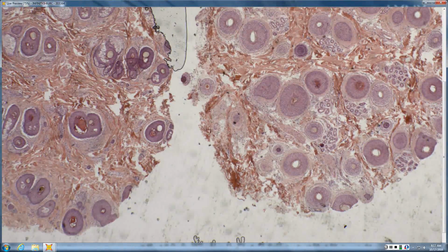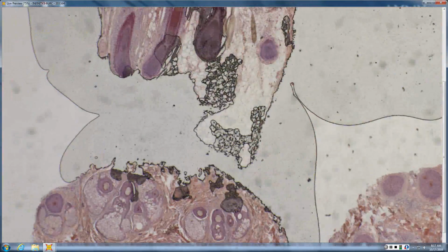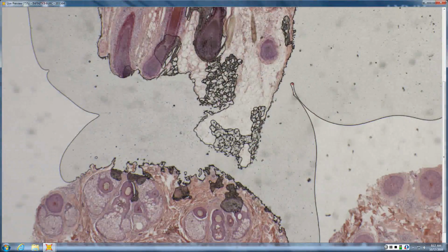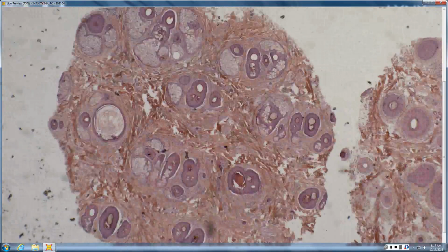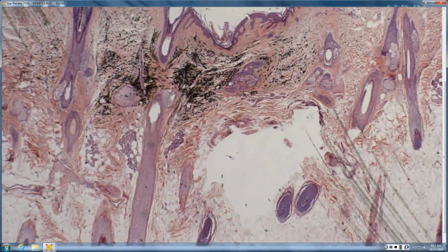So now you're going to look to see in the vertical sections, do I have any lymphoid infiltrates around the hair bulb, eosinophils around the hair bulb, pigment within the fibrous tract remnants? Those would all suggest AA or syphilis. We don't see any of those things. And the outcome was this was trichotillomania. And traction, but not old traction, new traction. Traction looks similar to trichotil. That is correct. So we should say trichotil/traction.